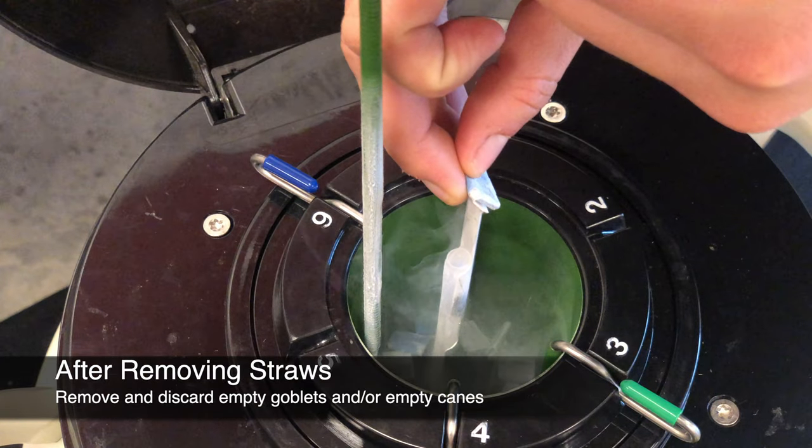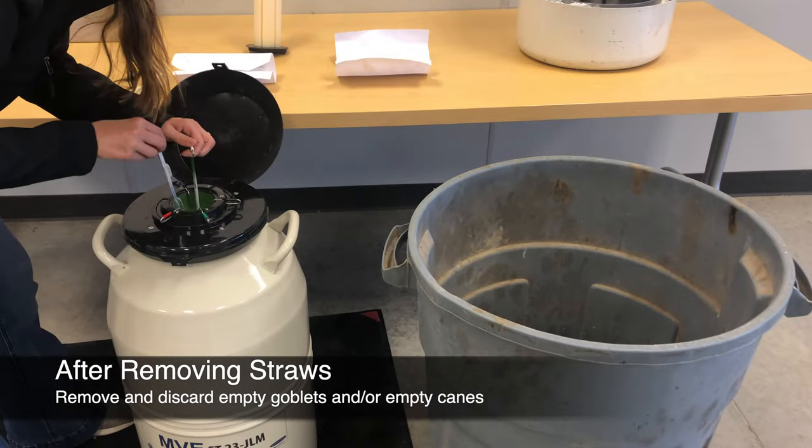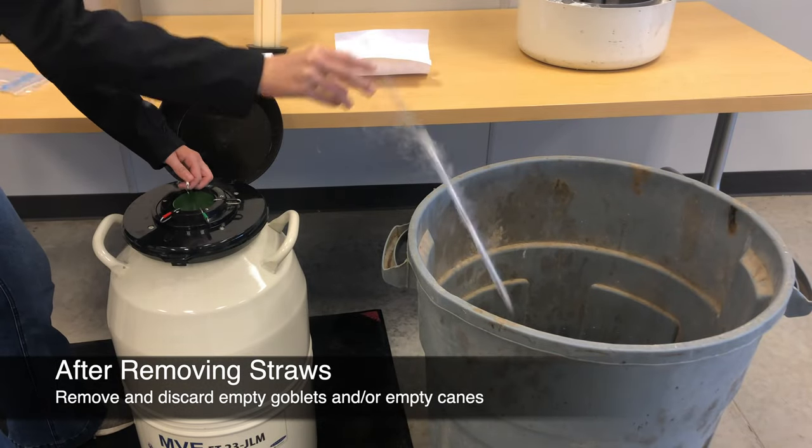When you have used all of the straws from the top goblet, remove the top goblet from the cane and discard it. When you have retrieved all of the straws from the bottom goblet, remove and discard the cane.